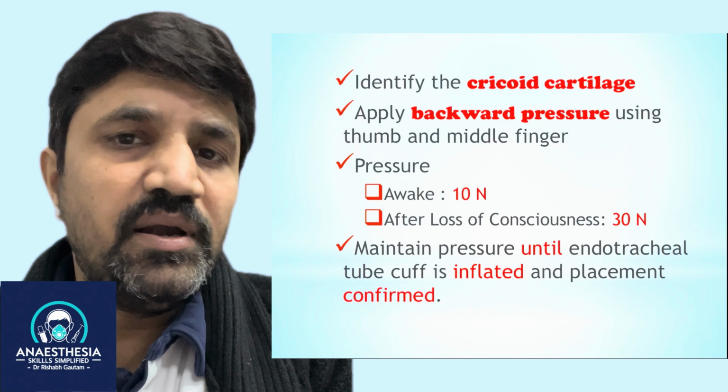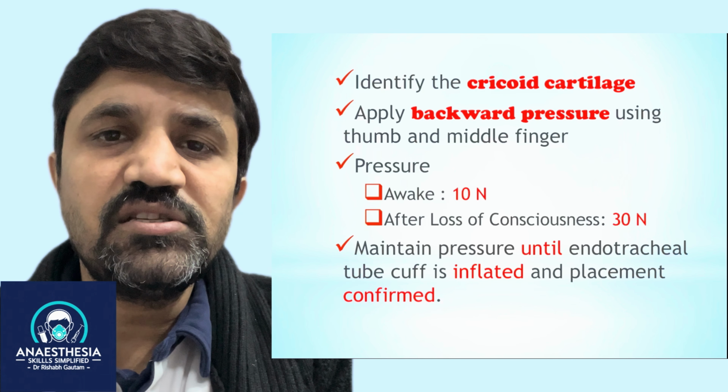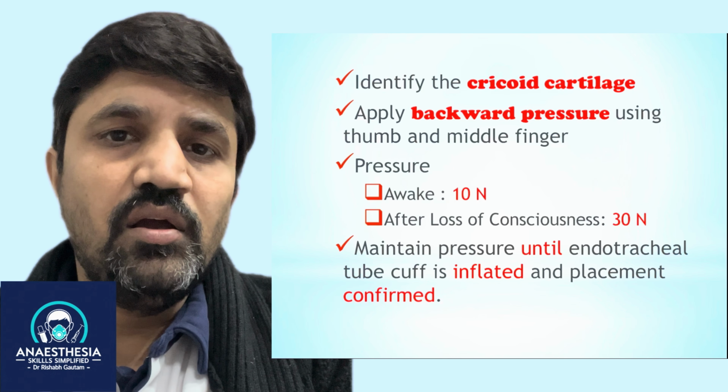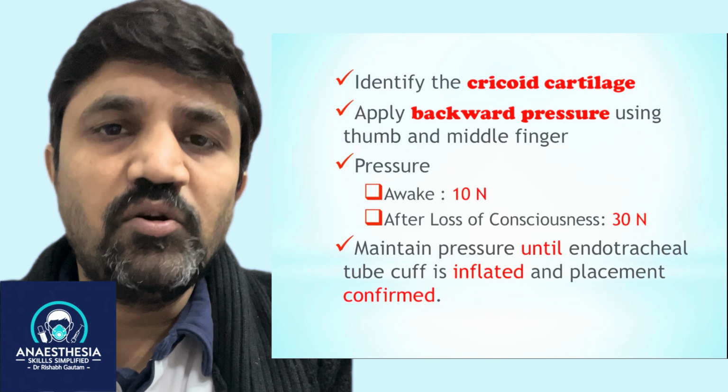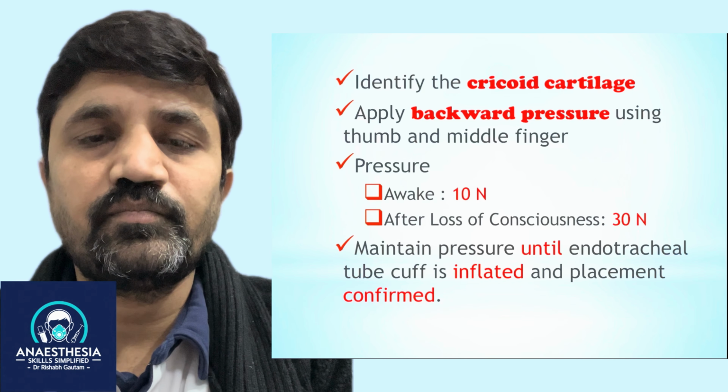You should maintain this pressure until the tube is placed and confirmed with cuff inflation. You have to release the cricoid pressure only after the cuff inflation, not before that.